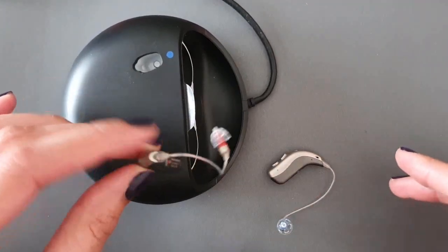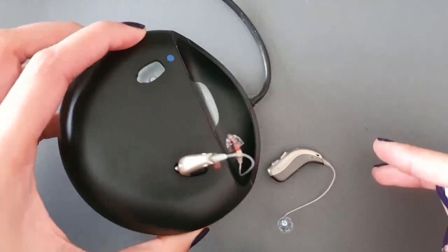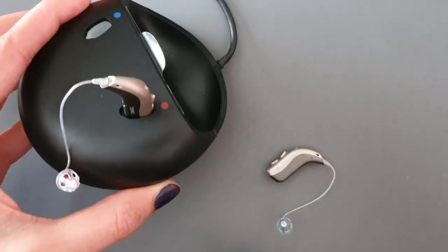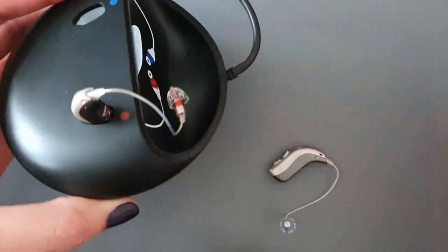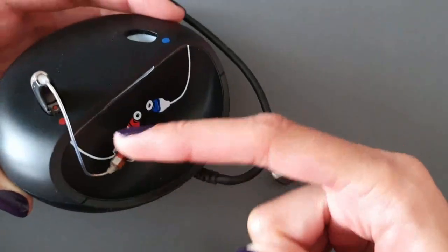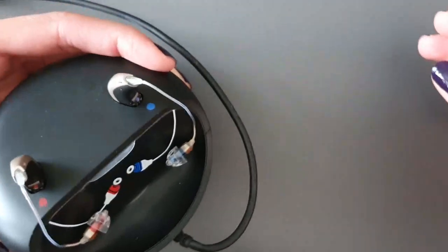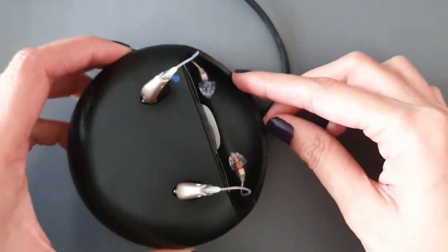When you go to bed or need to charge the instruments, you need to dock them into your charger. Note that the hearing aid can only go in one correct way — the incorrect orientation will not work. You need to make sure the hearing aid is docked so that the speaker wires align with this section and correctly match the picture drawn on your charger.